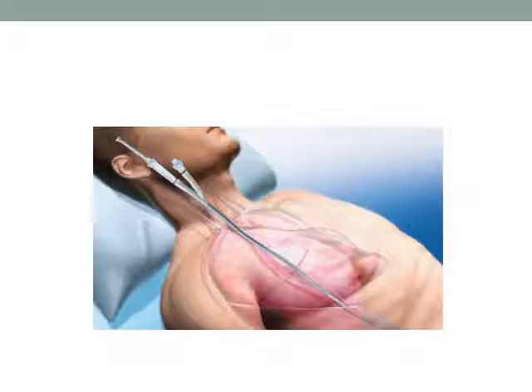Okay. So we have a wire going all the way down, a series of scary big dilators, and then finally this is put in over the wire, and when properly positioned, the tip is in the hepatic IVC, and we can drain blood from here and drain blood from here, and we return blood into the right atrium from this cannula.